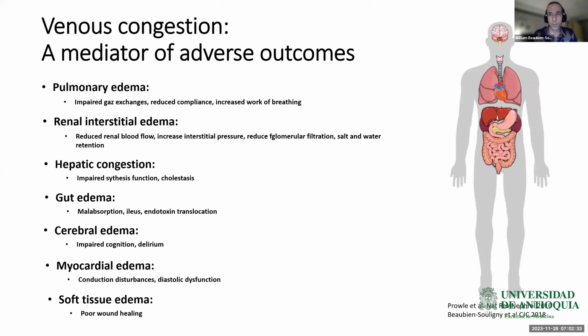And the same phenomenon can be seen in the kidney. By performing pulse wave Doppler on intrarenal vessels, we can see usually this pattern, which at the bottom of the screen is the venous flow. You can see that it is continuous during the cardiac cycle. And then after that, it becomes discontinuous as CVP increases because the venous system is becoming non-compliant. And in severe form, there is only a venous Doppler signal during a short period in diastole, which is the severe pattern, which demonstrates that kidney outflow is impaired due to high venous pressure.